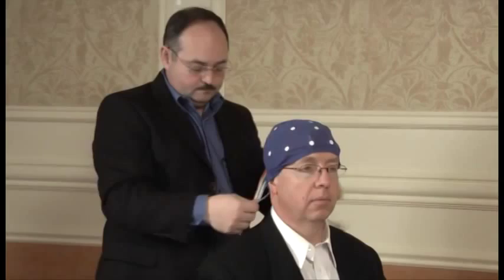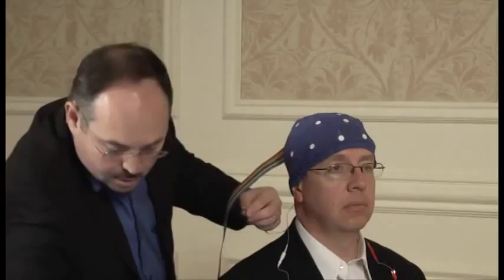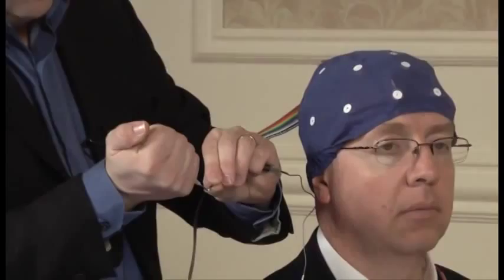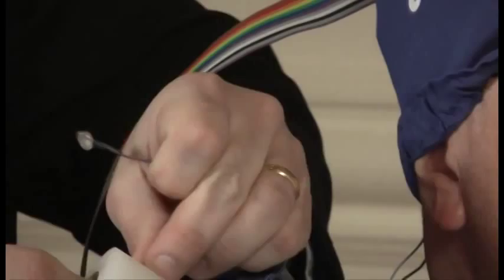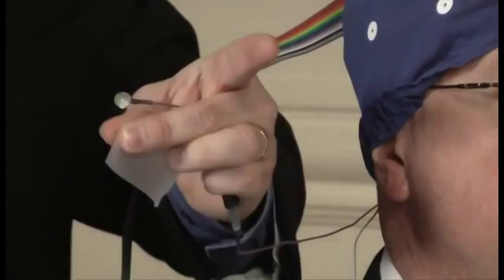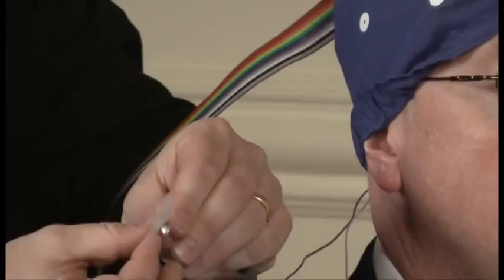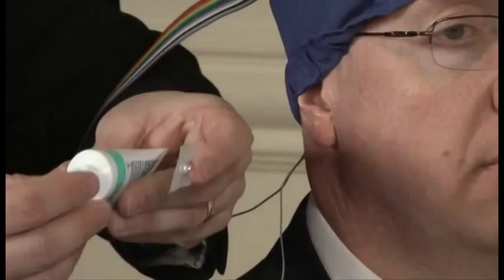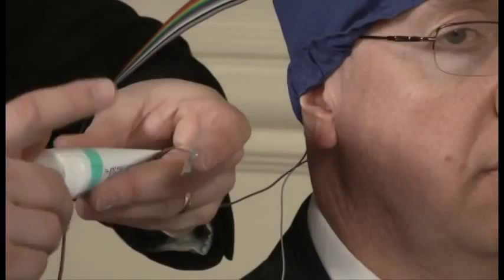You have the ear clip for the right ear and an ear clip for the left ear, and an ECG sensor. You'll put gel in the well of each of these sensors. For the ECG sensor, use a small piece of tape to hold it just above the clavicle in the soft tissue, adjacent to the clavicle on the left side. It's important to prepare the skin where you'll be placing the sensor.